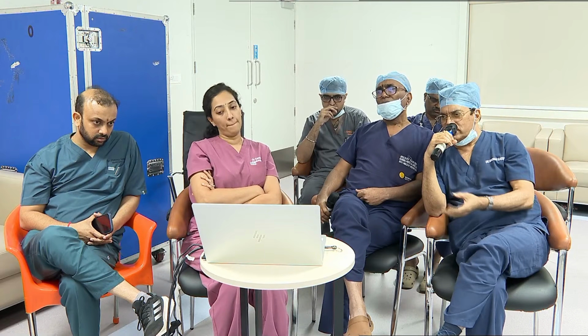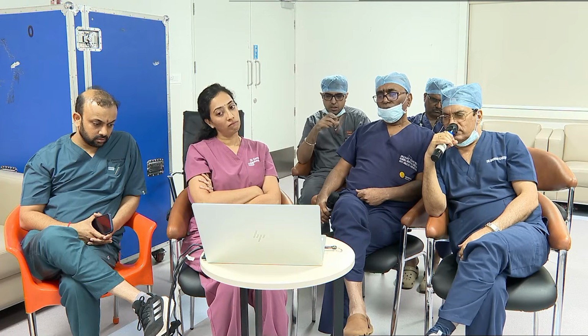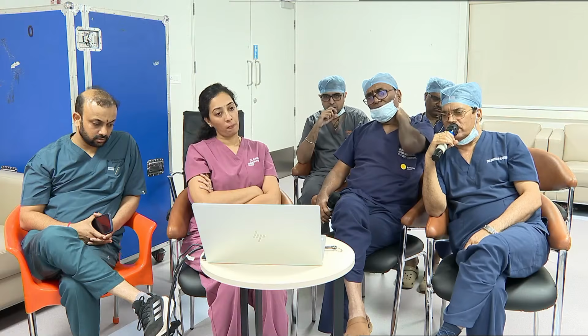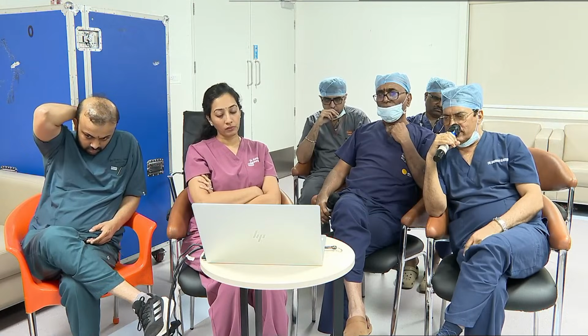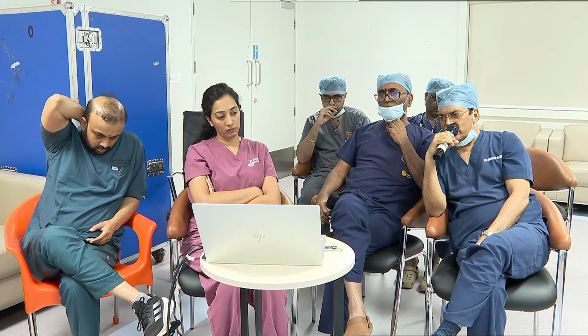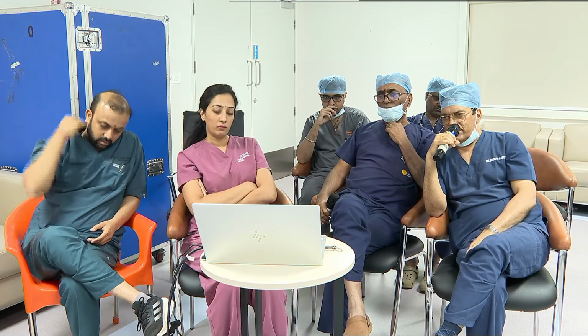Another one, narrow annulus. Narrow annulus and severe calcium. If you have narrow annulus, severe calcium, and use a balloon expandable valve, sometimes there are two common complications of severe calcium, especially in the presence of bicuspid. One is annular rupture, another paravalvular leak. Sometimes the calcium may extend to the LVOT, especially on the non-coronary cusp side, that is toward the bundle of His.